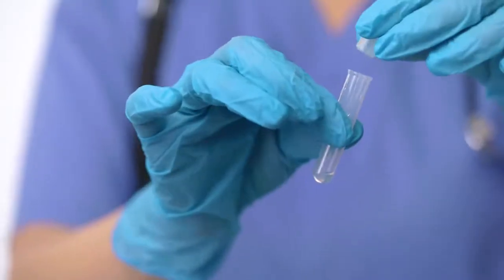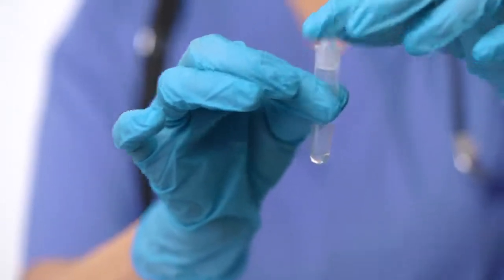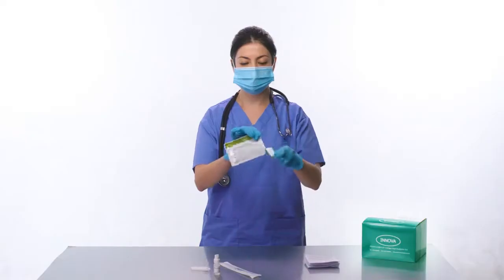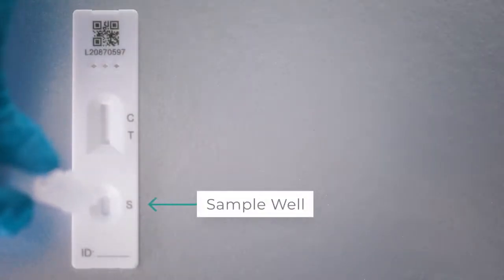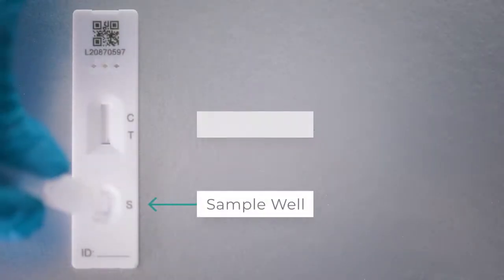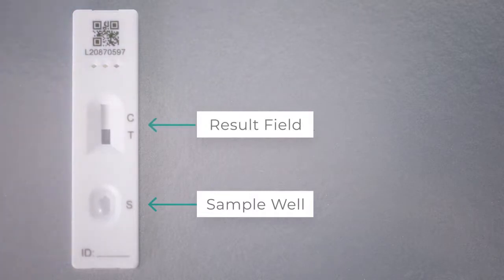Install the nozzle cap onto the extraction tube by pushing it in. Use the test immediately after removing it from its pouch, being careful not to touch the result field. Place two drops into the sample well of the test cartridge, making sure that the drops are delivered into the sample well and not the result field.